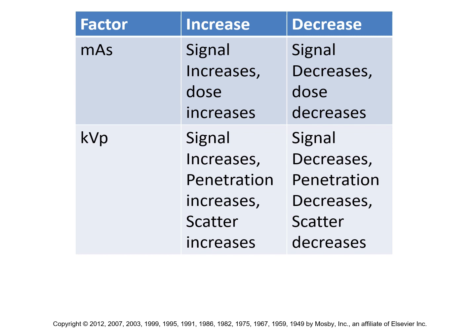Okay. You ever tune to a television channel back in the old days that had no one broadcasting on it, and you just got the snow pattern? They call that white noise now. That's what increasing scatter does. It's introducing that noise type of quality.